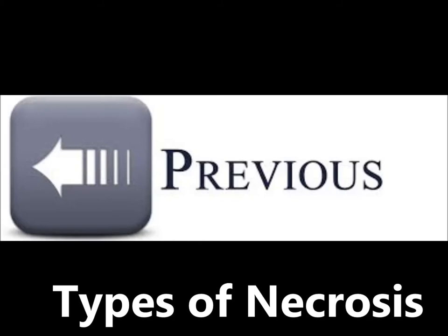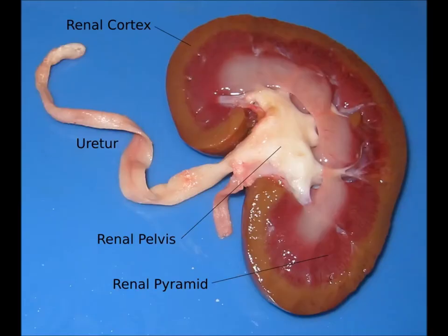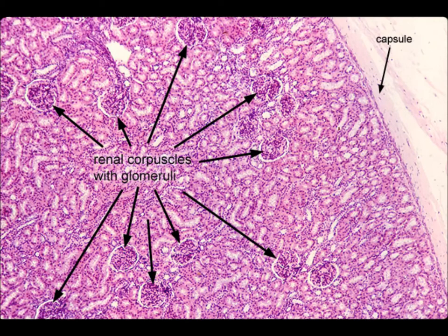First we will see the cut section of the kidney. A normal kidney on cut section has a nice outer cortex, medulla, renal pelvis, and attached ureter. There is no focal defect and there is homogeneous color.